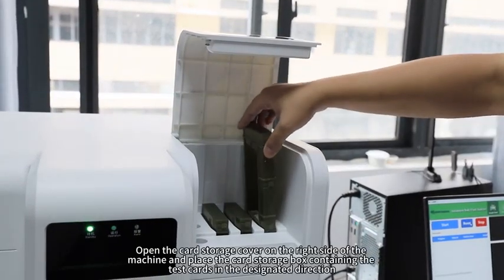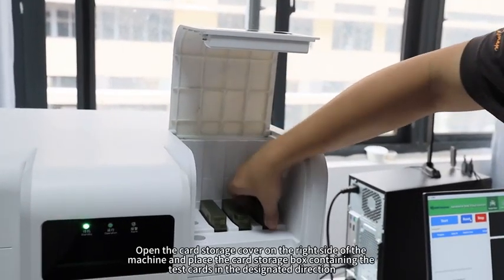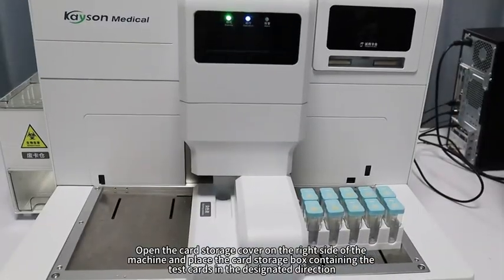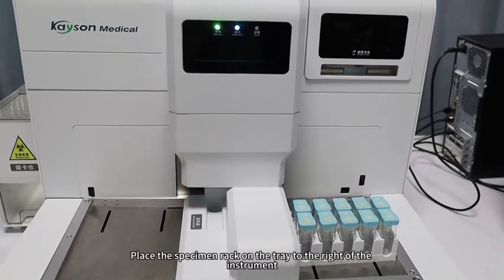Sample Loading: Open the card storage cover on the right side of the machine and place the card storage box containing the test cards in the designated direction. Place the specimen rack on the tray to the right of the instrument.